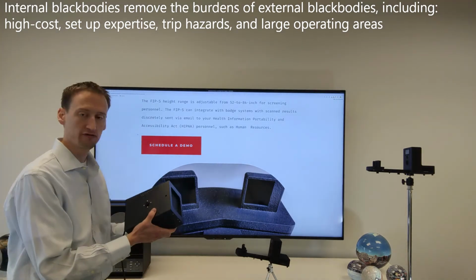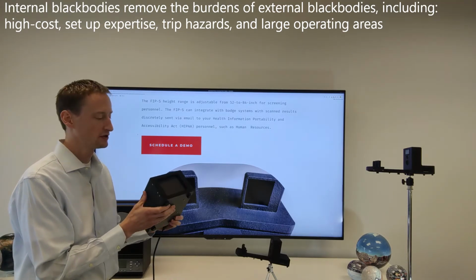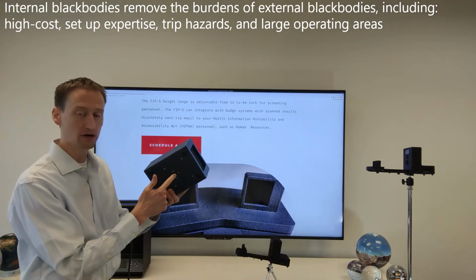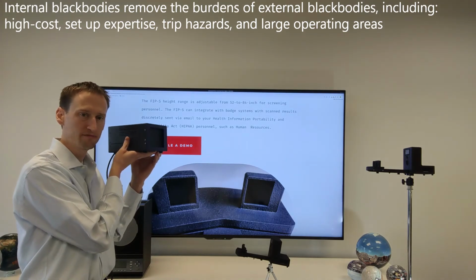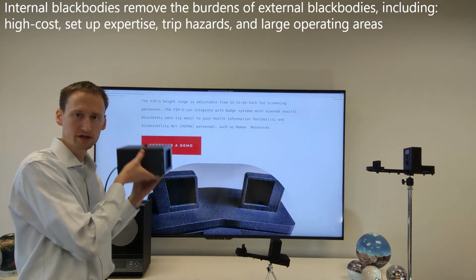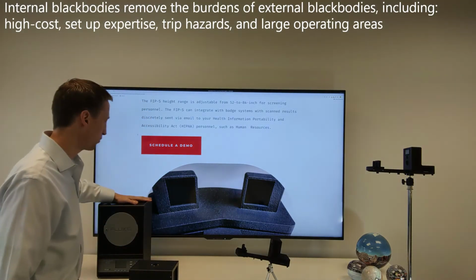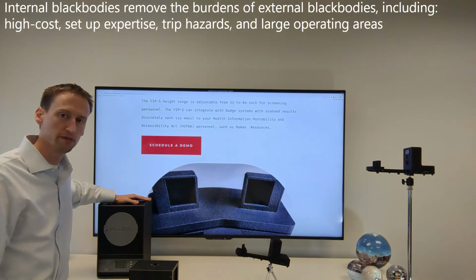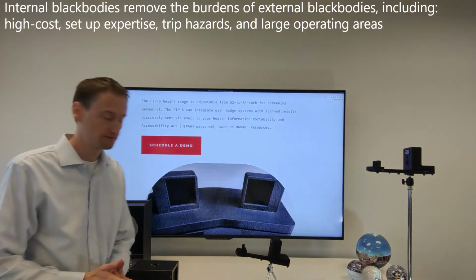This is a standard off-the-shelf black body that's specified for this purpose and accurate over a very narrow range. It's $1,300. It must be mounted on a tripod, approximately near where the subject's head is going to be, at the same distance to target. There are more expensive black bodies that let you do more things, and they will hold their stability much longer, but they're much more expensive. This particular unit is over $8,000.